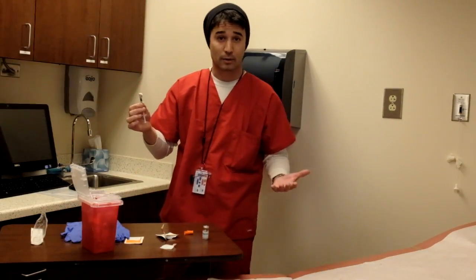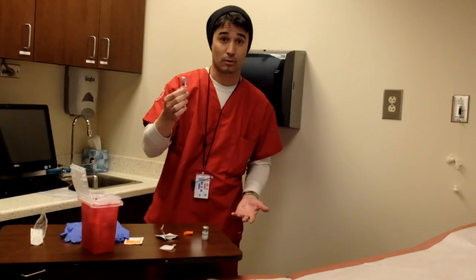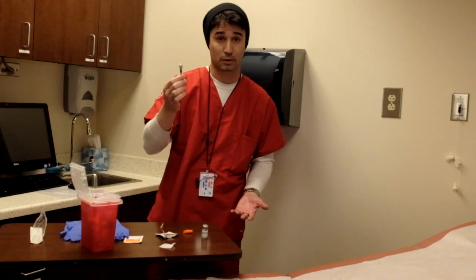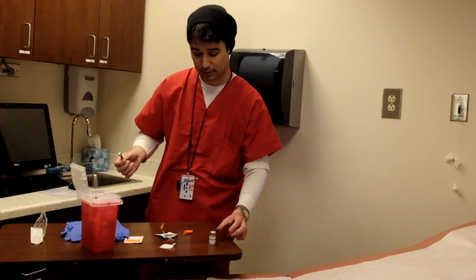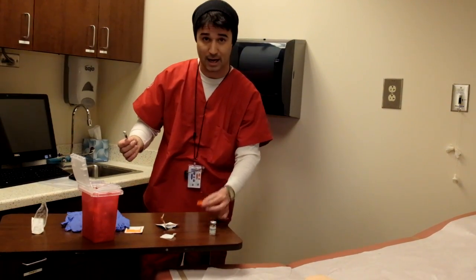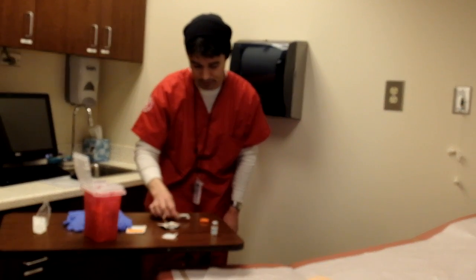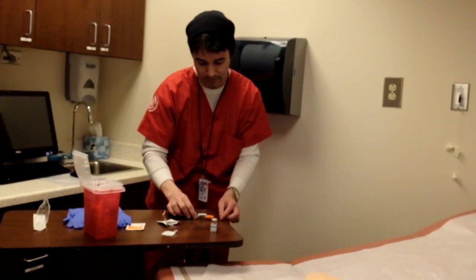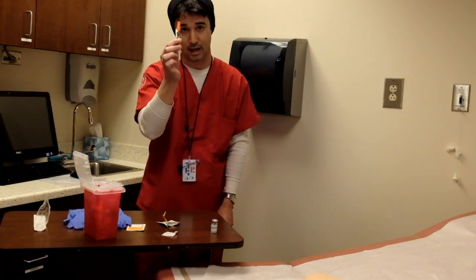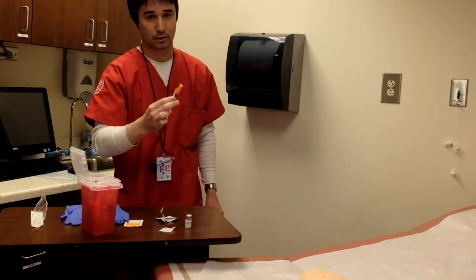Now we need to find a way to get this medication to the client's room — we don't want to be running around a hallway with a sharp needle. So we're going to go ahead and cap this needle on the syringe. The best way to do that is to use the scoop method: just put the cap down flat on top of the surface, then scoop the needle into the cap, nice and safe. And from there, we're going to the patient's room.